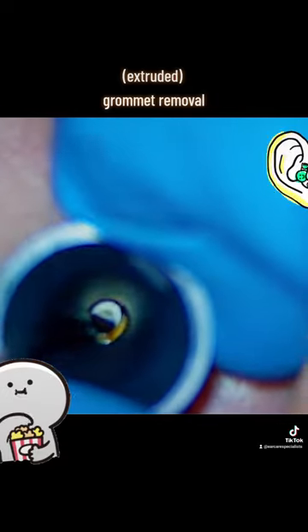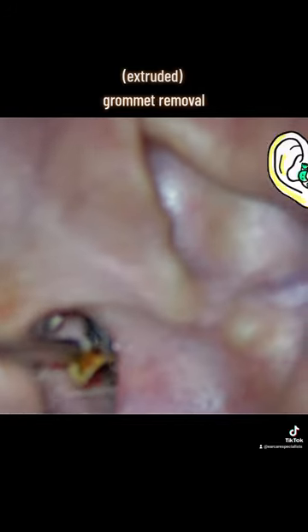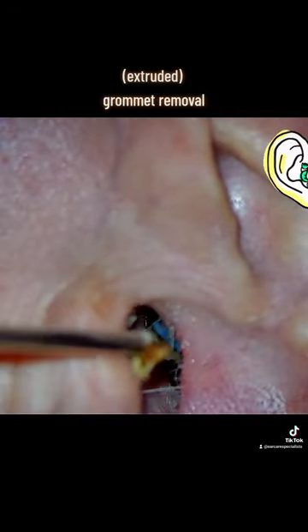So we just go in and remove it carefully from their ear, very tiny little thing, out it comes, and then we go back in and have a look at their eardrum, which was nicely healed.